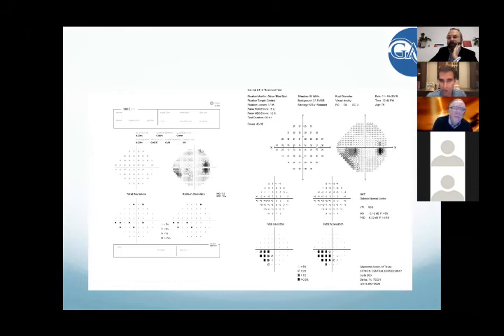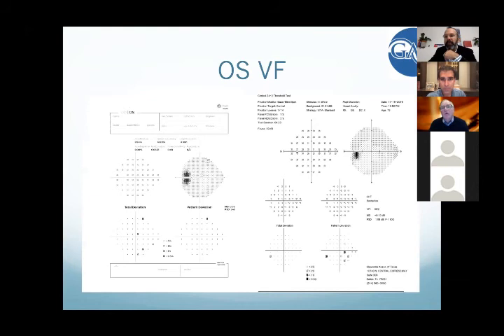You know, just another good example of this is the reliability indices on the VisuALL field compared to the reliability indices of the Humphrey are pretty significantly different here, which we're seeing more. I mean, when people like that interface, I think we're seeing that more. No, that's a good point. We believe that that might be related to the isolation from the, so when you are on a Humphrey or any other bowl perimeter, you are still in a real world, and it's very easy to be distracted by anything.